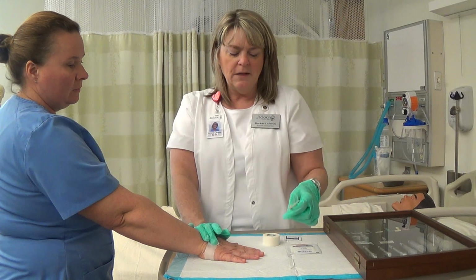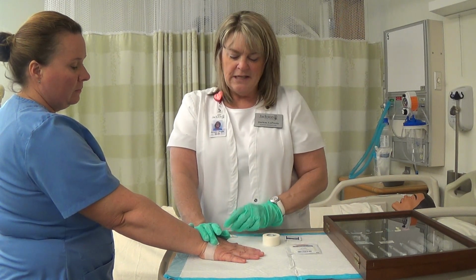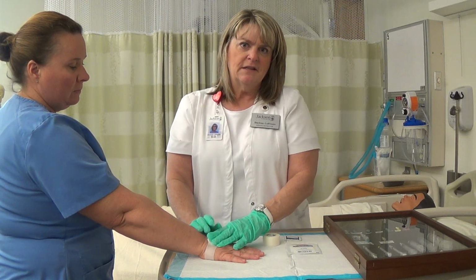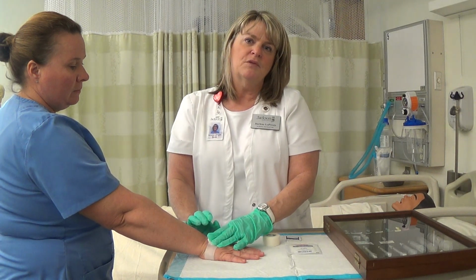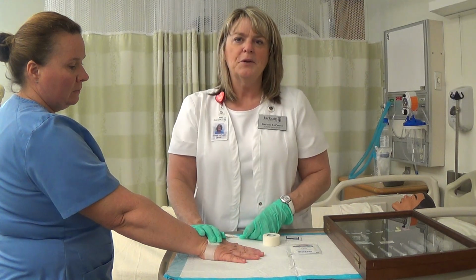And then when we document this in the chart, we document what size it was, what time and date that we removed it, the assessment of the site that there was no redness or tenderness, no pain, and that the catheter was removed intact. And that is the end of discontinuing an IV catheter.